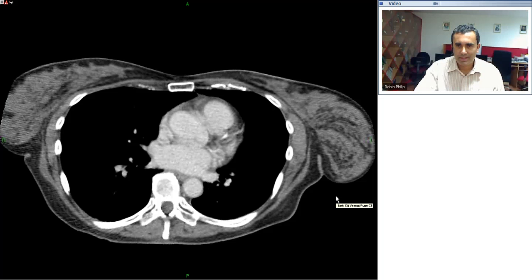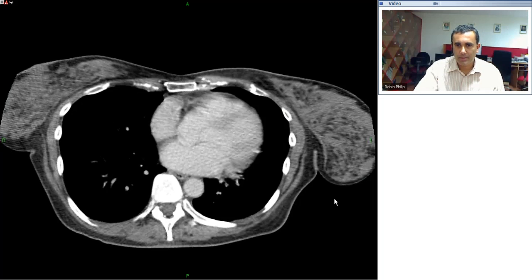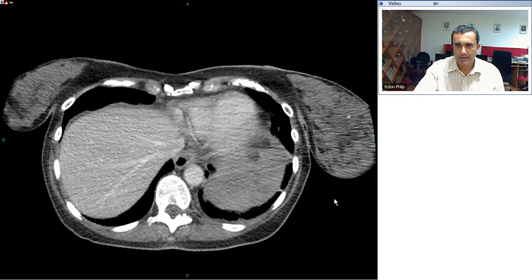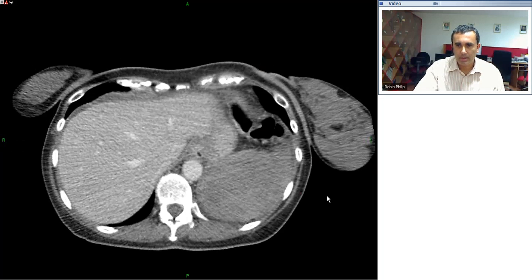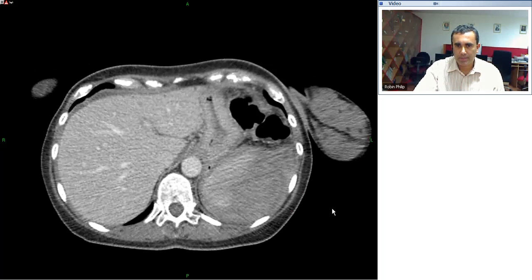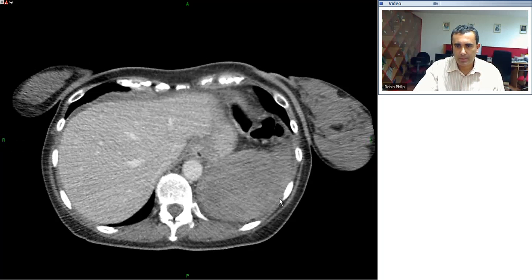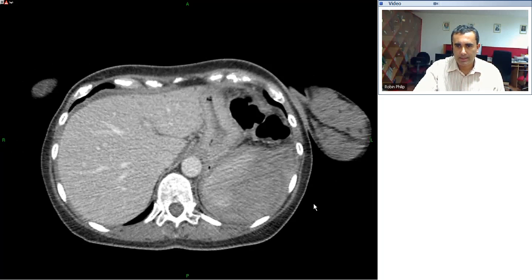Here's an interesting case from the emergency room: a patient who underwent colonoscopy one day previously and is now presenting with left upper quadrant abdominal pain. As we scan through the lower thorax and the upper abdomen, we start to see that there is a left subdiaphragmatic collection, extremely heterogeneous with some high density components to it.